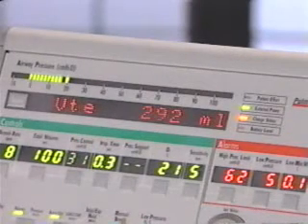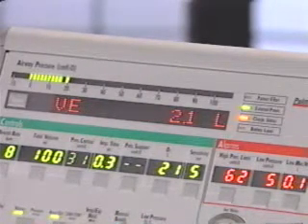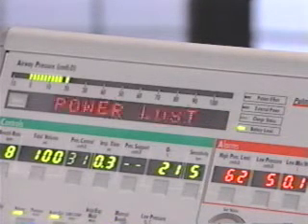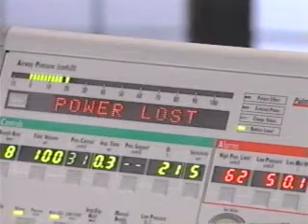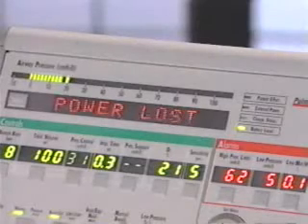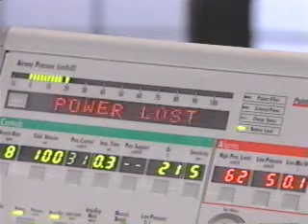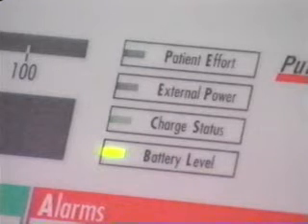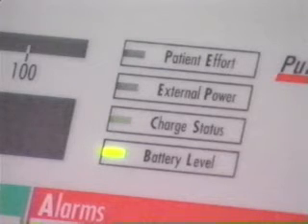The power lost alarm occurs when the ventilator is operating on external power and switches to the internal battery. The change to internal battery is made when the external power voltage drops below the usable level. There is no interruption in ventilation. When a power lost alarm occurs, the power lost message is flashed in the display window, the external power and charge status LEDs are turned off, and the battery level LED is lit, showing the internal battery charge level. The ventilator begins operating from the internal battery and the audible alarm is sounded.